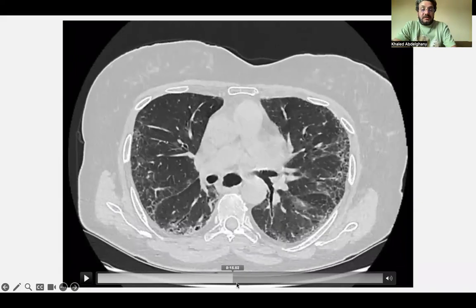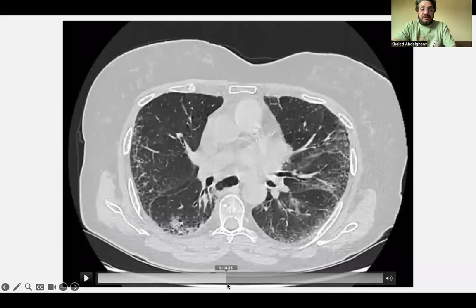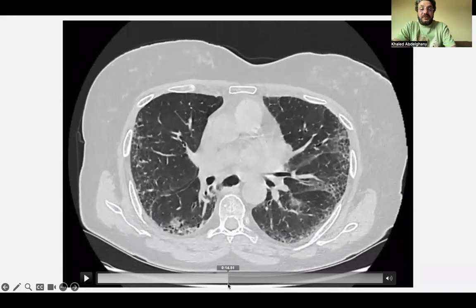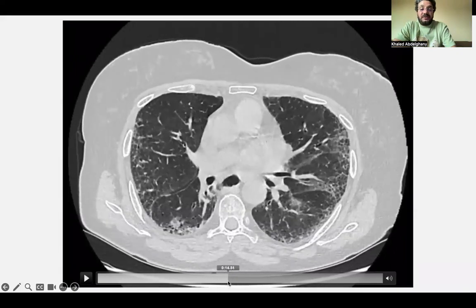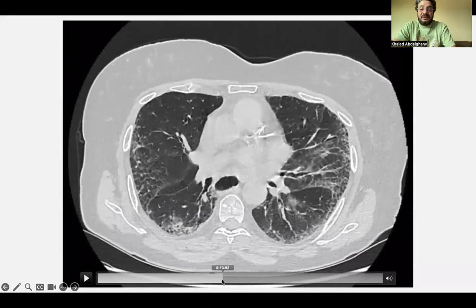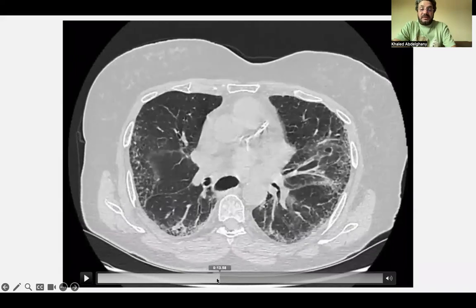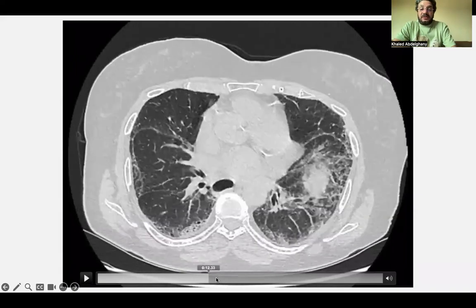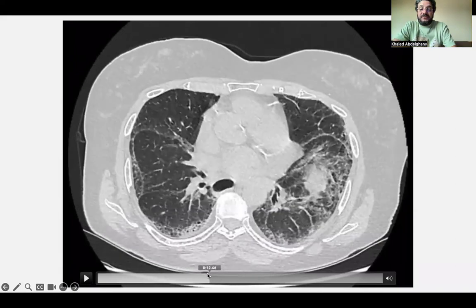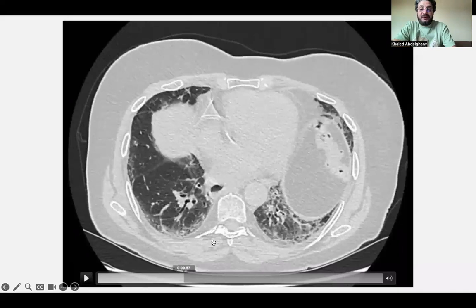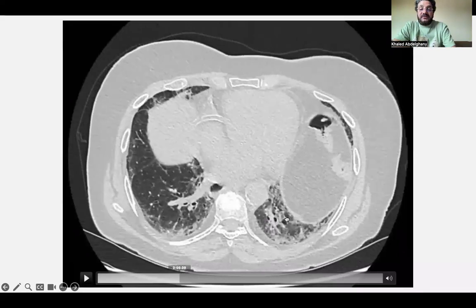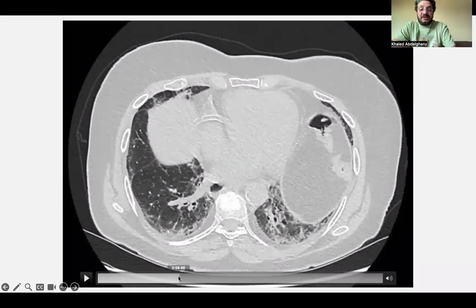There is no left triad of bronchocentric fibrosis — that is traction bronchiectasis, irregular reticulation, and ground glass opacity — which is absent here. The bronchi have continuity to the periphery without fibrosis. They arrive at the peripheral location near the diaphragm and the lung base. So this is where findings start to become peripheral: traction bronchiectasis, ground glass opacity, and irregular reticulation.